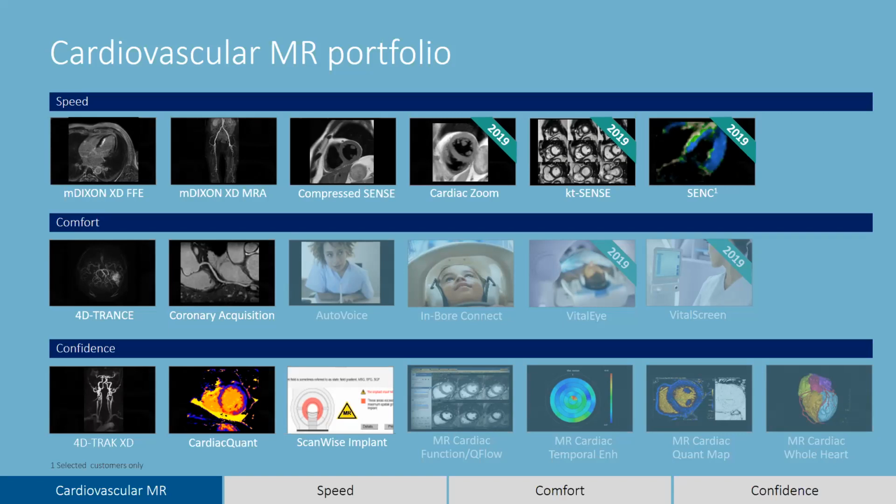But if we have some problem in the ECG triggering, we can use the PPU, the pulse unit. It's similar to the ECG, and we can do the cardiac MRI in some sequences without the triggering. Of course, we can't do it for everything, because we still have some acquisitions that include free breath holding, and some that are used with free breathing.